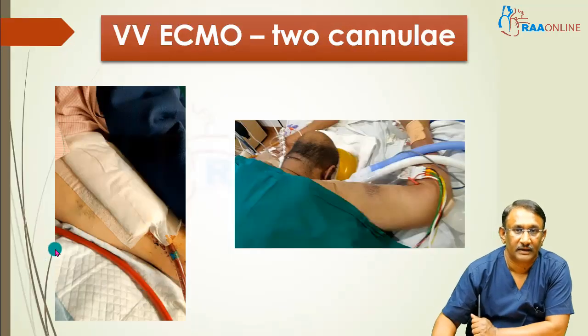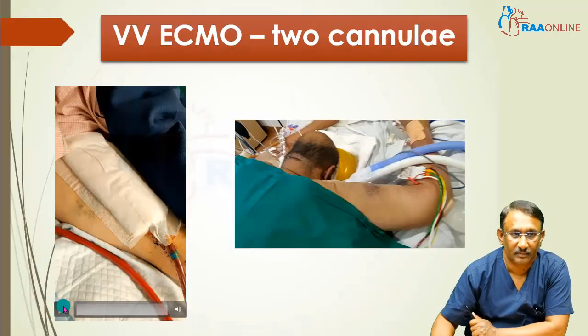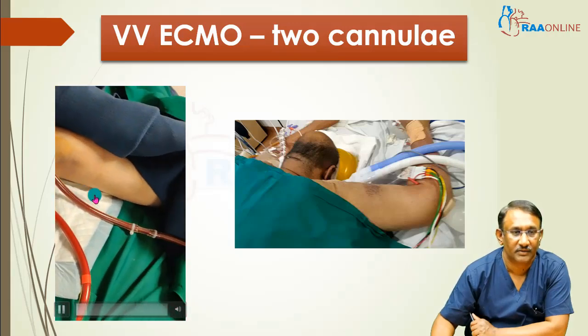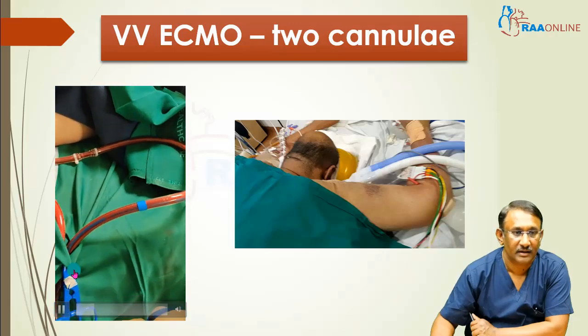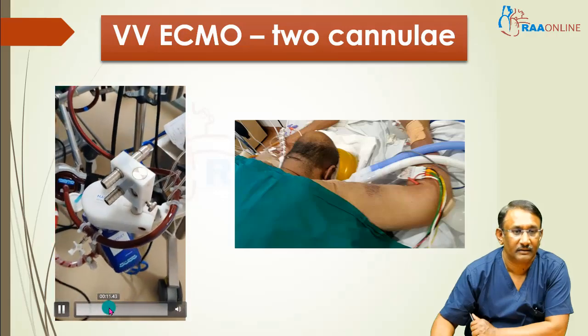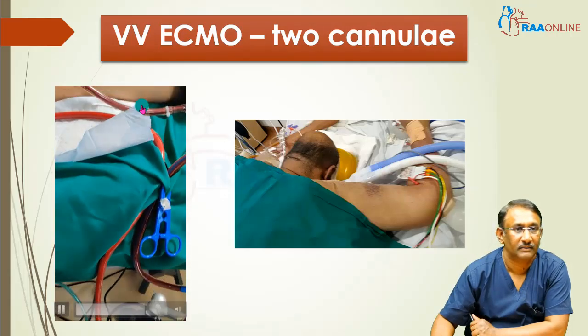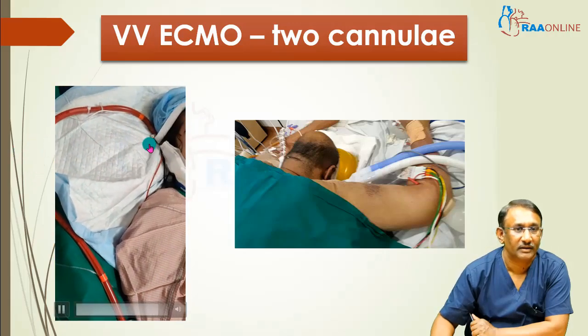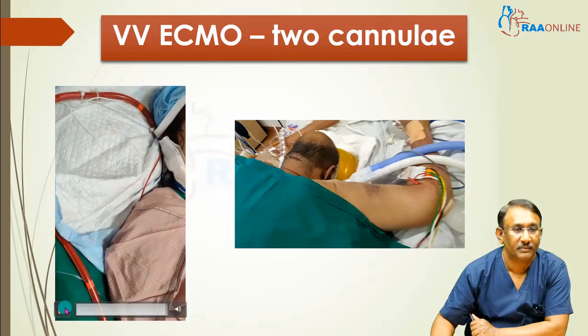These are two different types of veno-venous ECMO. Both of these again have two cannulae. This video shows that this particular patient is having drainage from the leg. That is, you have used the femoral vein, IVC, to drain. It comes to the ECMO. Then the post-membrane blood, which is bright, goes back to the patient. And the return cannula we have put in the neck. So this is a femorojugular combination of two separate cannulae for the VV ECMO.